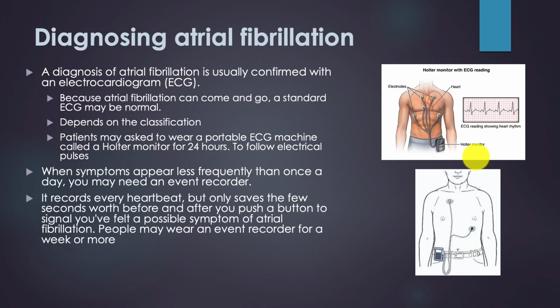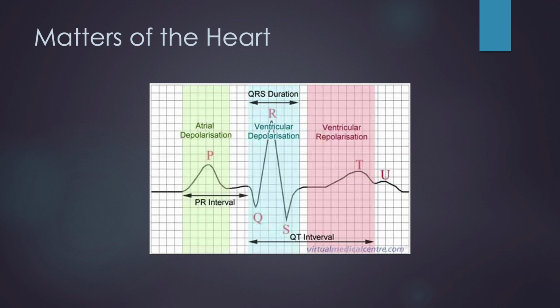And basically, after the monitor is removed, a technician will look at all the electrical activity of your heart and be able to determine what is going on with the heart and with the rhythm, and determine if there is any AFib or arrhythmias. So let's talk about this.